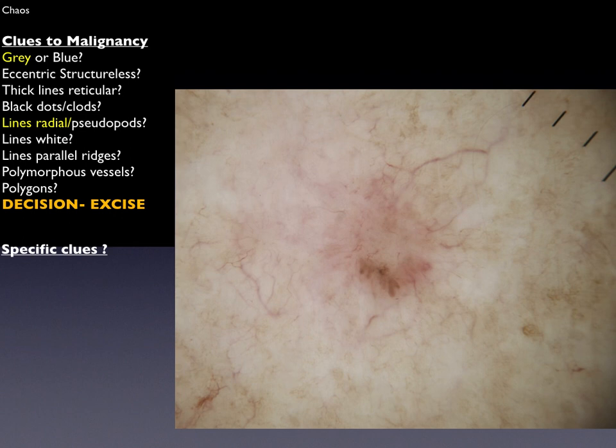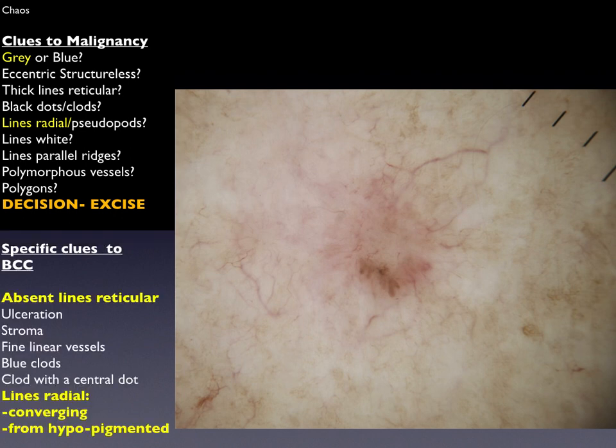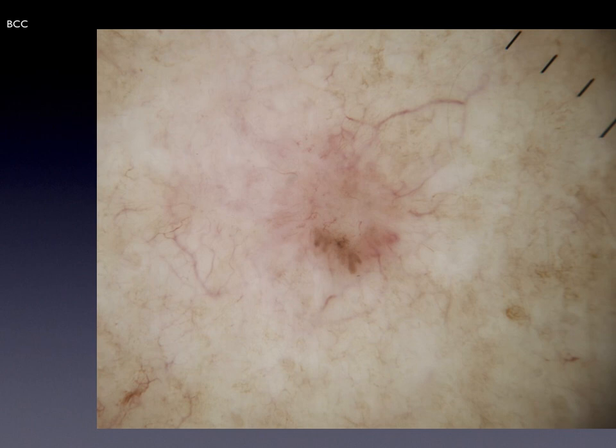The decision is made to excise, and then we look for specific clues to a diagnosis. In this case, absent lines reticular as well as lines radial converging and extending from a hypopigmented area points to a diagnosis of basal cell carcinoma.